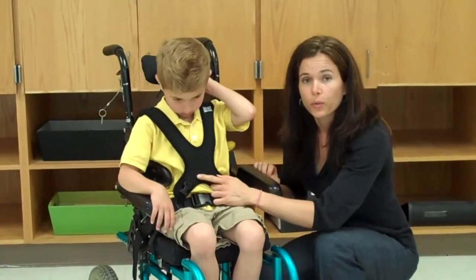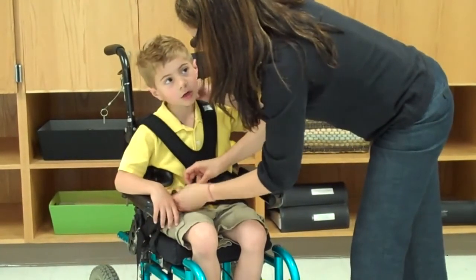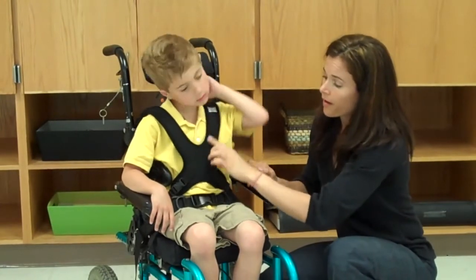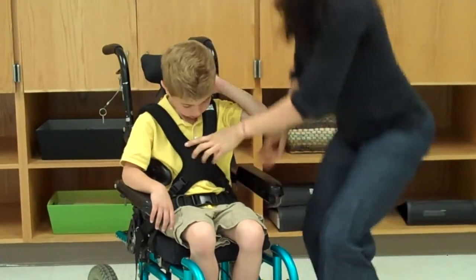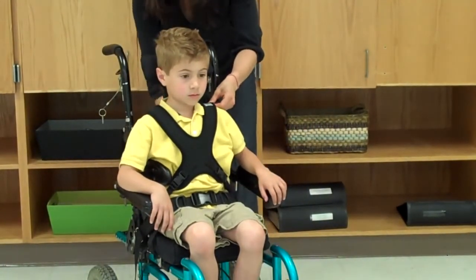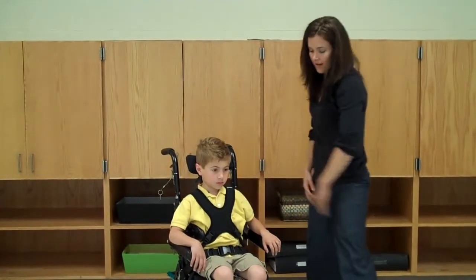When putting the anterior chest support on, it is very important to clip the bottom clips first. Once they're clipped, you want to go ahead and tighten them up. This will make sure that the top part of the anterior chest support won't be coming around the child's neck. From this point, we're going to go to the top and clip those clips. And from here, we'll give them a nice tug and firm them up. This will help keep the child's chest upright while he's positioned in the chair. I think he looks pretty good.